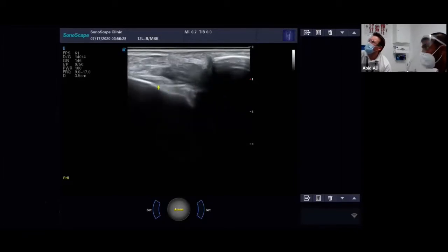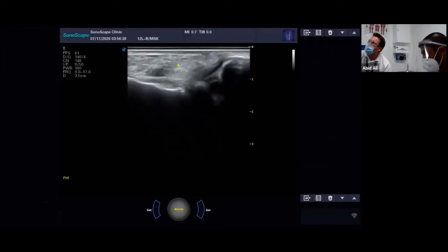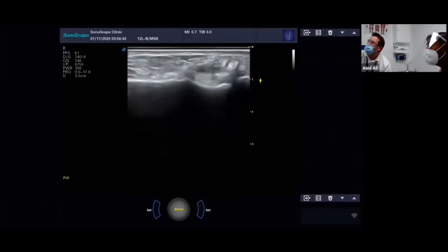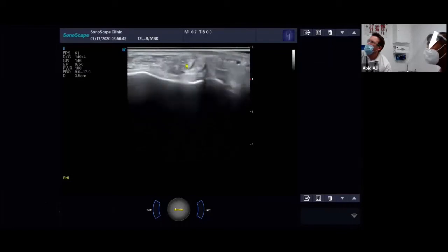Yeah, so this is a bit of it here. So that's it going up here, and it sits like a hammock under these. These are the peroneals. So I'll just show them the peroneal tendons. Yeah. In cross section. So there's the peroneals, and this is the CFL here. Peroneus brevis and longus there, sitting side by side. Almost looks like that yin yang sign. Yeah. And that's the CFL coming under here.